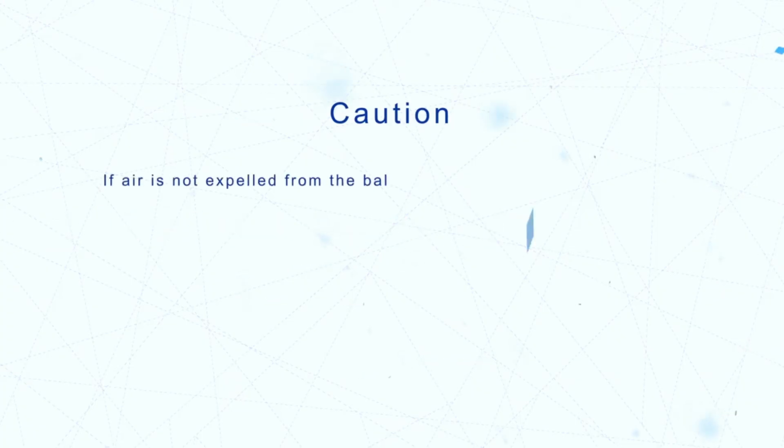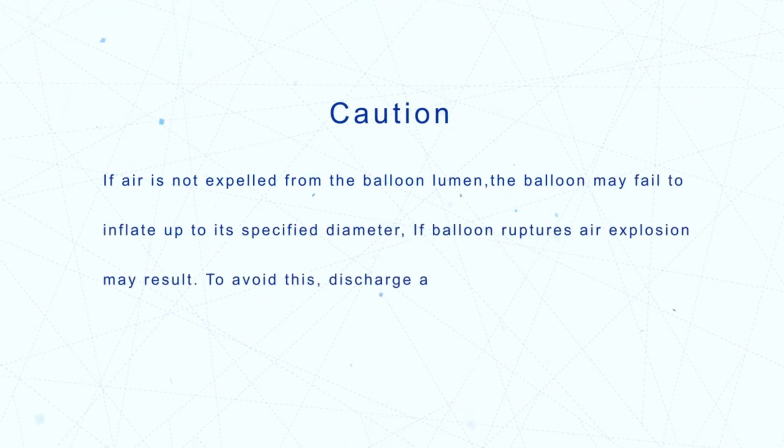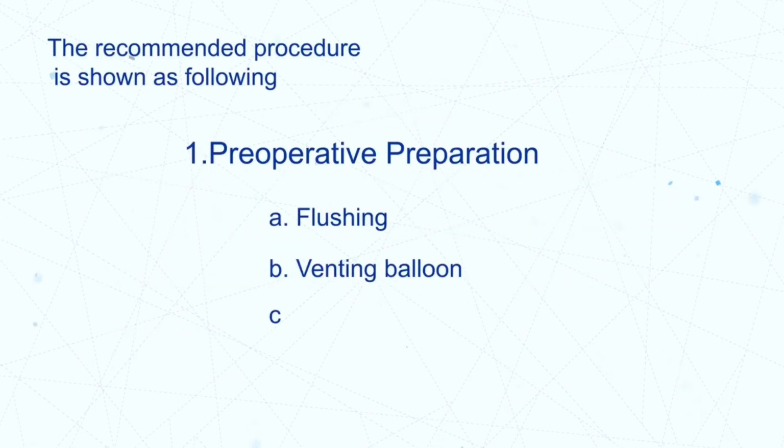Caution: if air is not expelled from the balloon lumen, the balloon may fail to inflate up to its specified diameter. If the balloon ruptures, air explosion may result. To avoid this, discharge air from the balloon lumen completely.